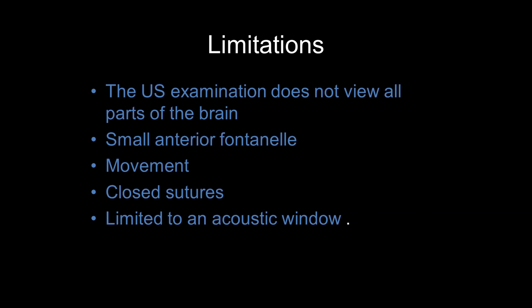ventricular dilation. When you get a preterm infant that is 60 to 90 days of age, people also measure the anterior horn width. And what they have found is if your anterior horn width is greater than 6 millimetres, it is not associated with post-hemorrhagic hydrocephalus, but these ventricles are just getting bigger to fill up the space of brain that has not been growing.